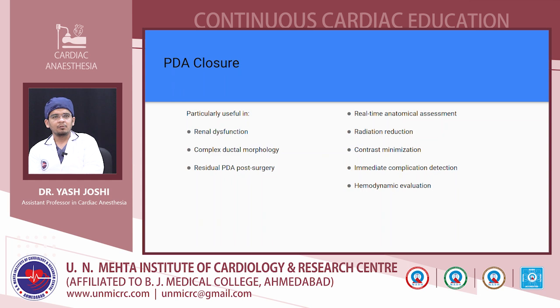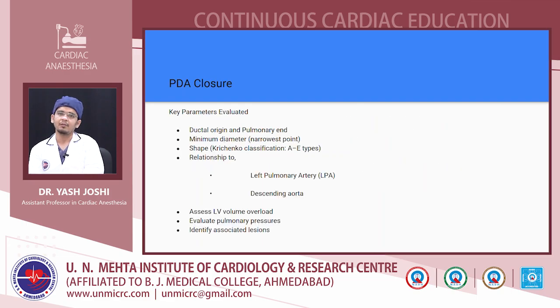TE is also helpful for PDA closure. Particularly, it is helpful in a renal dysfunction child, complex ductal morphology, and residual PDA after surgery. It is helpful in real-time anatomical assessment, radiation reduction, contrast minimization, immediate complication detection, as well as hemodynamic assessment to check the volume overload on the left ventricle.